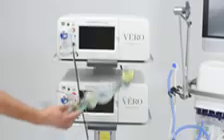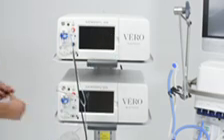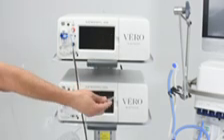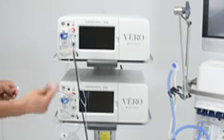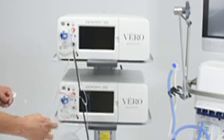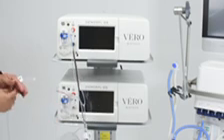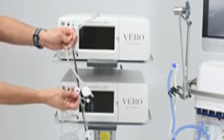To set up the manual ventilation bag connection, push and twist clockwise the end of the manual ventilation line, clear, to the manual ventilation port, clear, on the front panel of the top and bottom console. Connect the manual ventilation line to the NO injection port of the manual ventilation bag NO adapter.